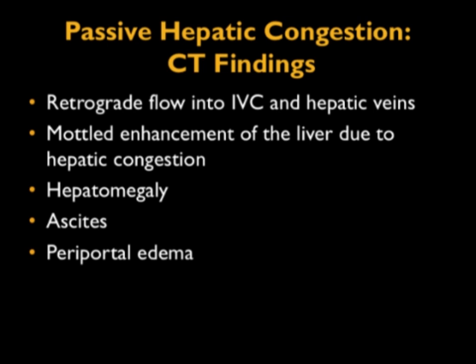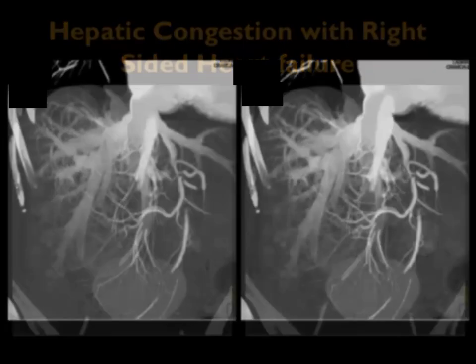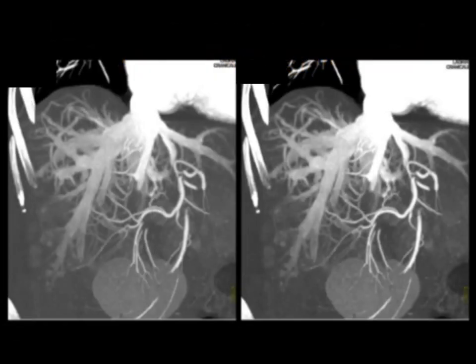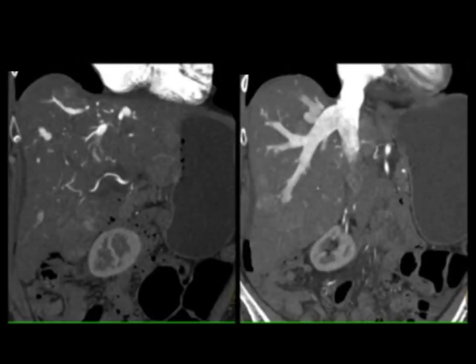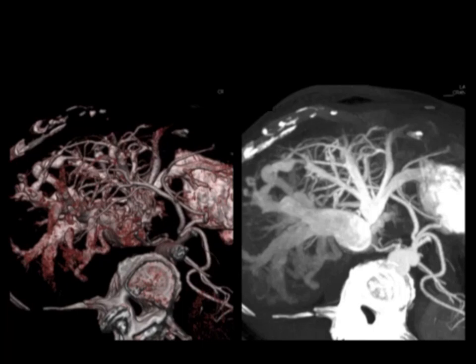You can see a mottled enhancement pattern due to congestion, hepatomegaly, ascites, and periportal edema. Here's a beautiful example — look at the right side of the heart and look at the impressive reflux down the IVC and the hepatic veins, very nicely seen on various images and on 3D mapping. There's no other way to get that visualization of the veins than reflux down the IVC. A very classic case of cardiac cirrhosis and changes related to poor cardiac function.